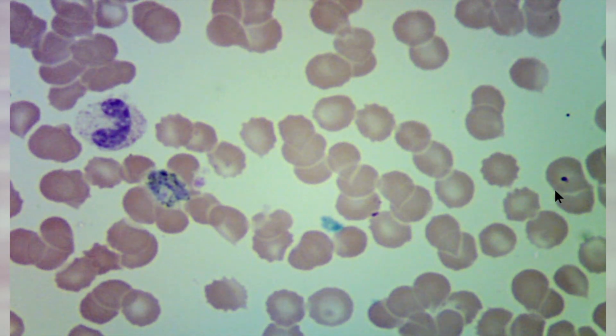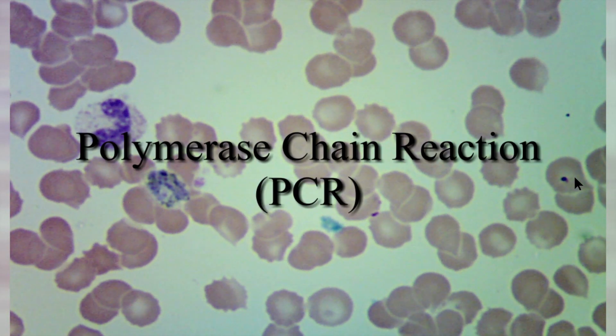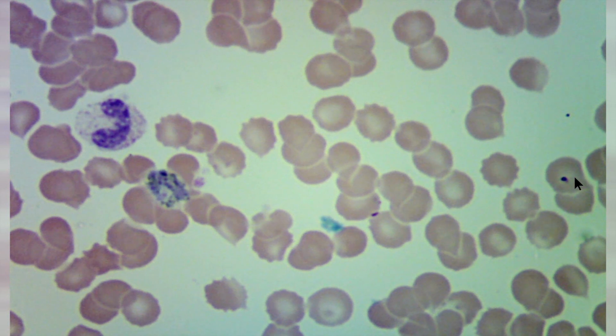if I use that, it appears to be a Howell-Jolly body, which again, people with malaria infection can develop splenomegaly, and perhaps the presence of Howell-Jolly bodies could be indicative of problems and stress on the spleen. So this is a very important finding, and it should be noted very clearly to the physician and usually sent for confirmation for the species using polymerase chain reaction, PCR, to be able to exactly identify what species of malaria it is. So I would not include the exact species in my report, but I can always indicate I suspect, but PCR confirmation is required.